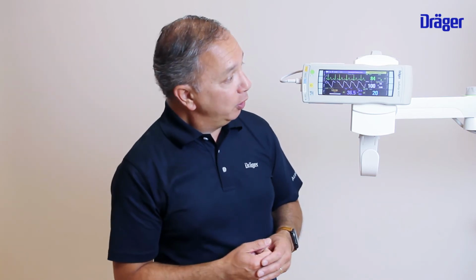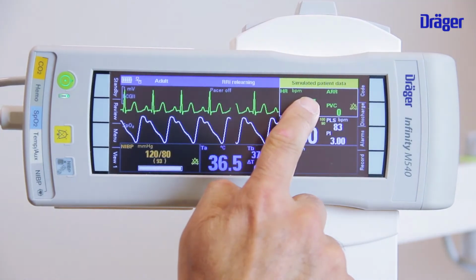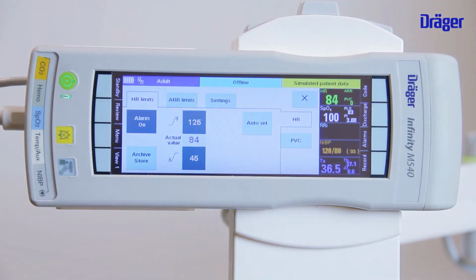As we use the M540 also for transport, the usage of the touchscreen is slightly different from the usage that you have with your smartphone. When you look at this touchscreen, the length of the touch is important, not the force of the touch.